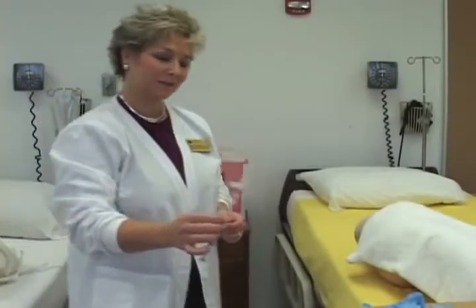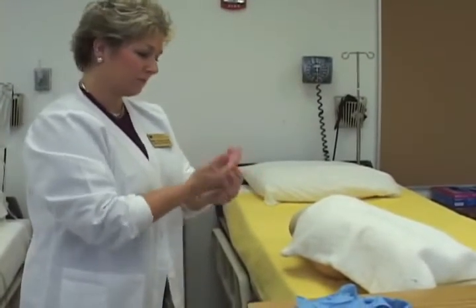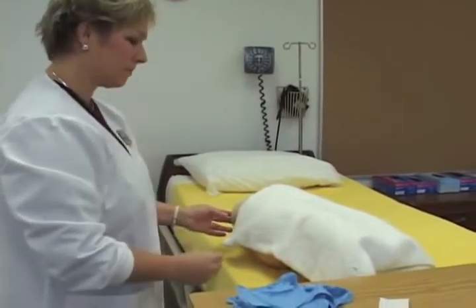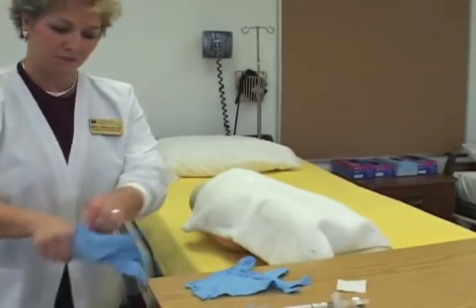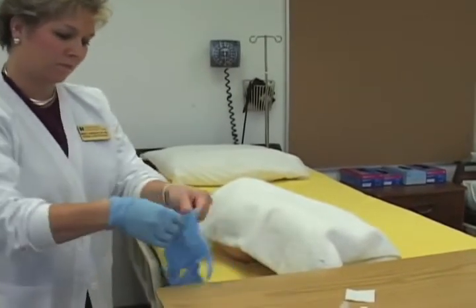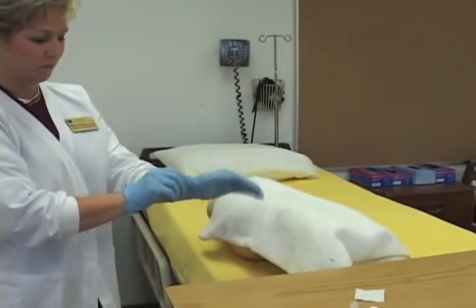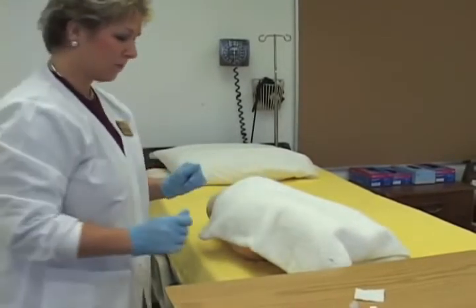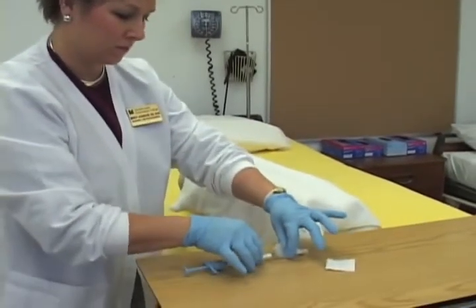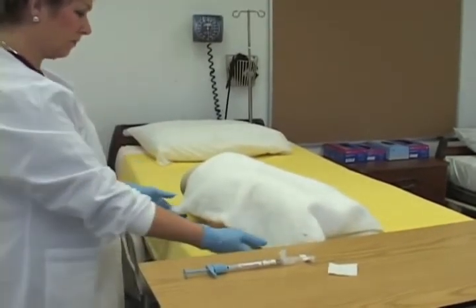At your patient's bedside, perform hand hygiene, verify correct client, explain procedure to client. Apply non-sterile gloves. Loosen but do not remove the needle cap and lay syringe in a safe place, such as the overbed table. Choose and identify the intended injection site.